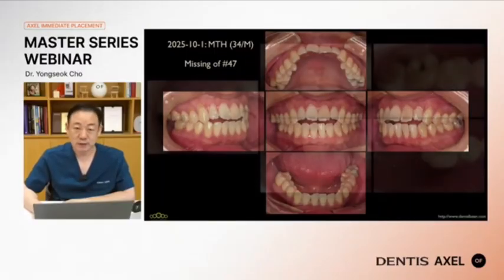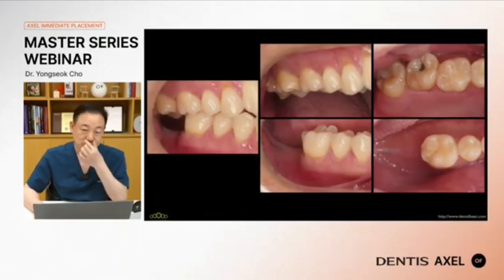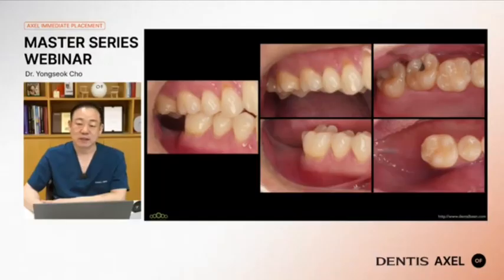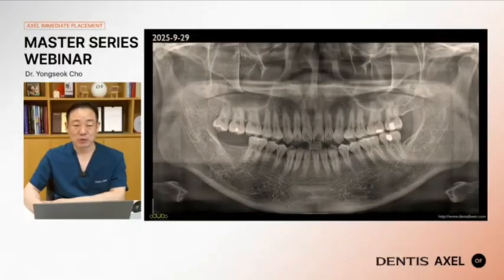The patient has an open bite condition, and it is healed like this. A typical pattern of number 7: slightly decreased keratinized tissue and a narrow ridge. However, the middle and basal bone is wide enough. Simply, we can do alveoloplasty and place the implant deep.